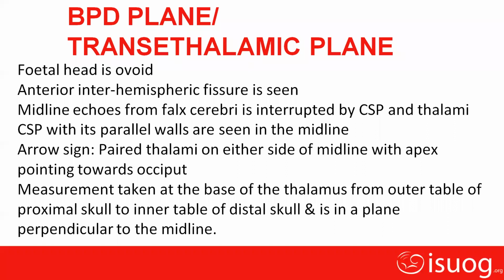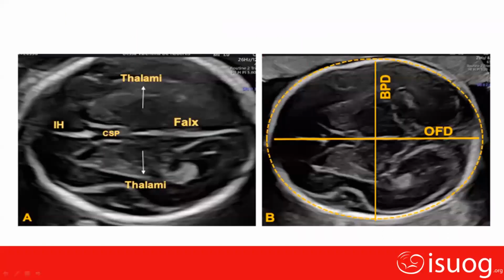Please keep the slide static when you're describing the thalamic plane. Show the transthalamic plane and stick there until you complete. Okay. So this is the BPD plane.